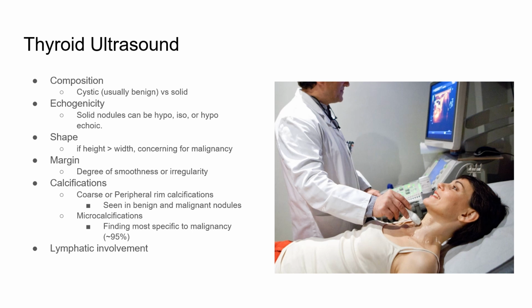So at this point, you would go ahead and get your thyroid ultrasound. Sometimes this is done by a cytopathologist that enjoys patient interaction and wants to have that opportunity to make that connection with their patient. And at other times, it is done by a rad tech or a radiologist. But the radiologist or that cytopathologist winds up looking for a few things that we kind of briefly touched on with TIRADS, and I'm going to get into right after this.